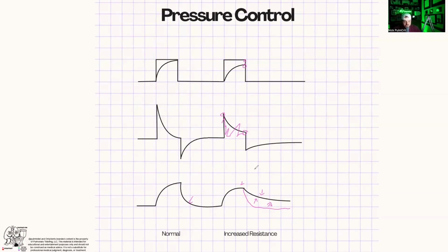And obviously in this situation, it's resistance. Similarly, because the pressure is less and your resistance is higher, your peak expiratory flow goes down and your time constant elongates. So, if we fired another breath here, right? This is sort of two of the signs of auto-PEEP. We have end expiratory flow, and we're not reaching the baseline, right? Because it doesn't get to this baseline.